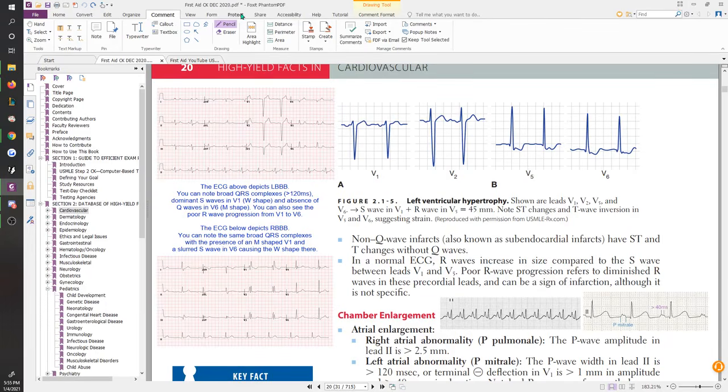So if I draw the baseline for you guys here, let me grab my line. You're going to notice, very apparent here, if I draw this baseline, you can see that the ST didn't come back down. It was supposed to be baseline, but it's got this kind of hump happening over there. And it's even more off baseline on the further right one. Okay, same thing here too. This is your baseline. You see how your ST didn't come back all the way?